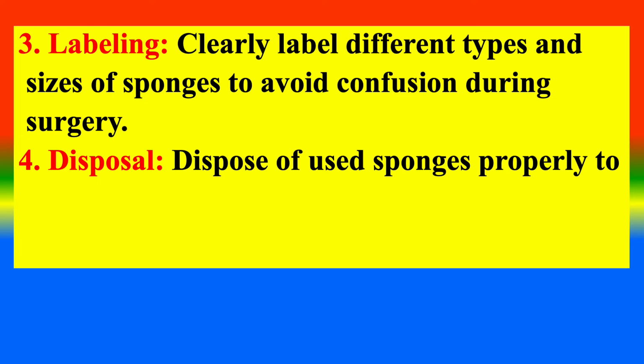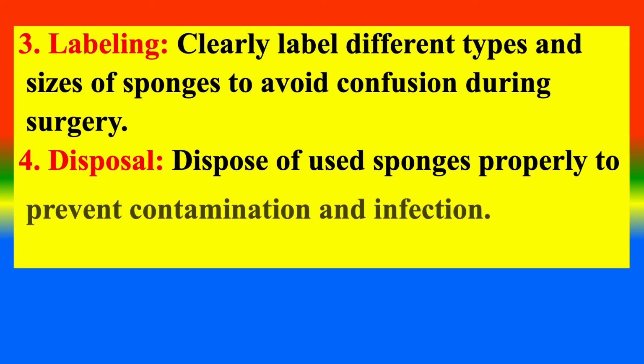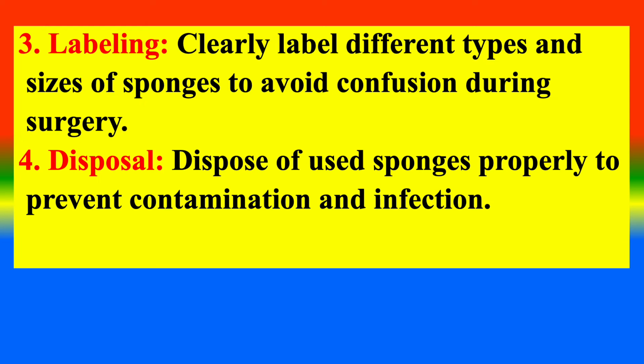4. Disposal, dispose of used sponges properly to prevent contamination and infections.